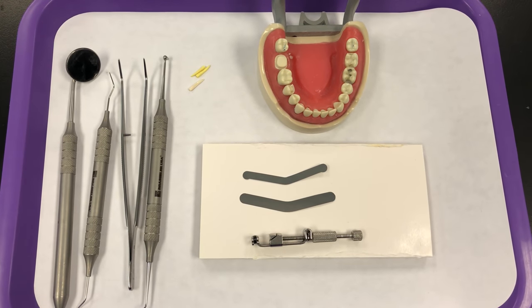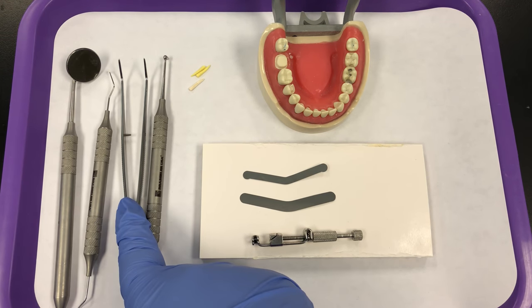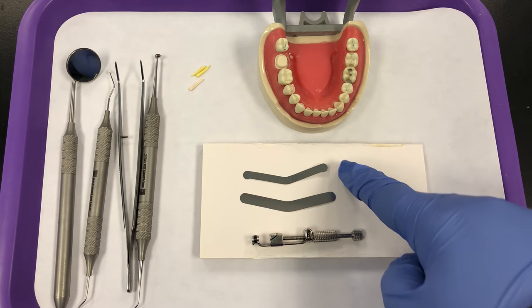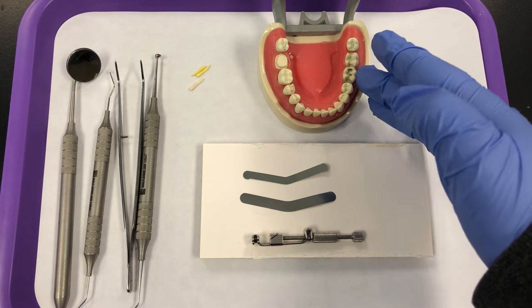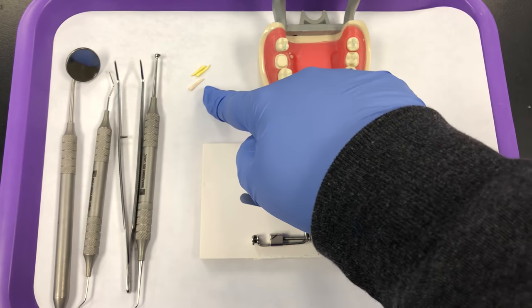This video is going to show you how to assemble a universal matrix band and retainer. I'm starting out with a basic setup with a mirror, explorer, and cotton pliers. I also need a burnisher. I have my matrix bands as well as a universal or Toffelmeyer retainer. I have my prepared teeth here, and for the demonstration we'll use tooth number 19. I also have some wood wedges.